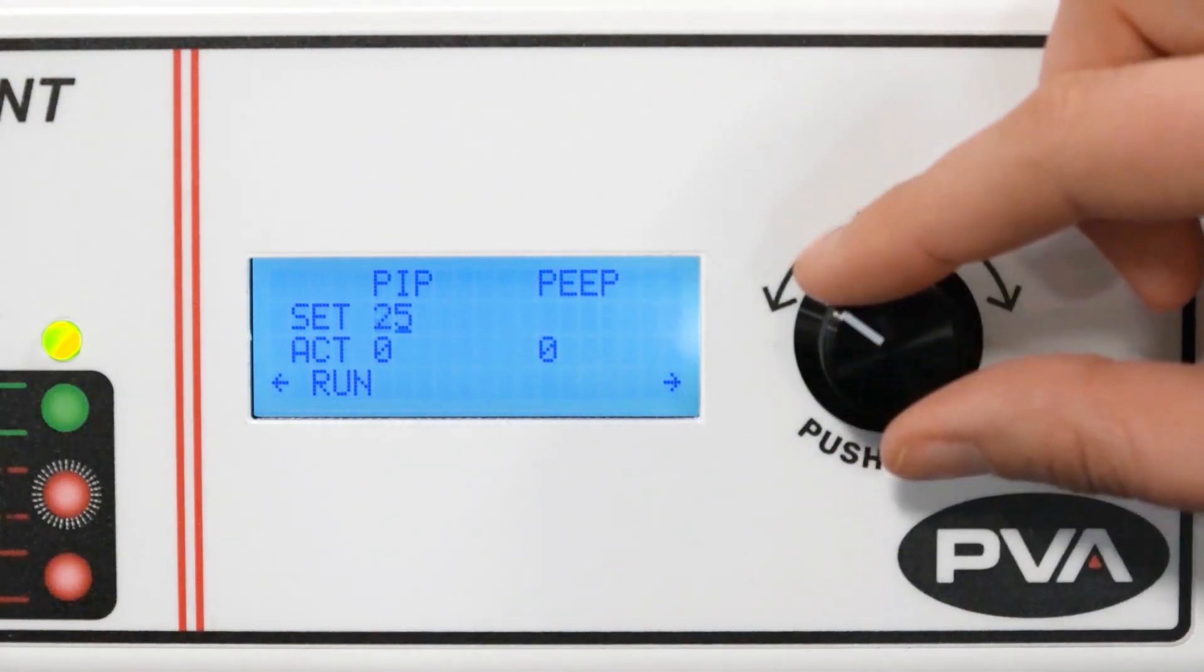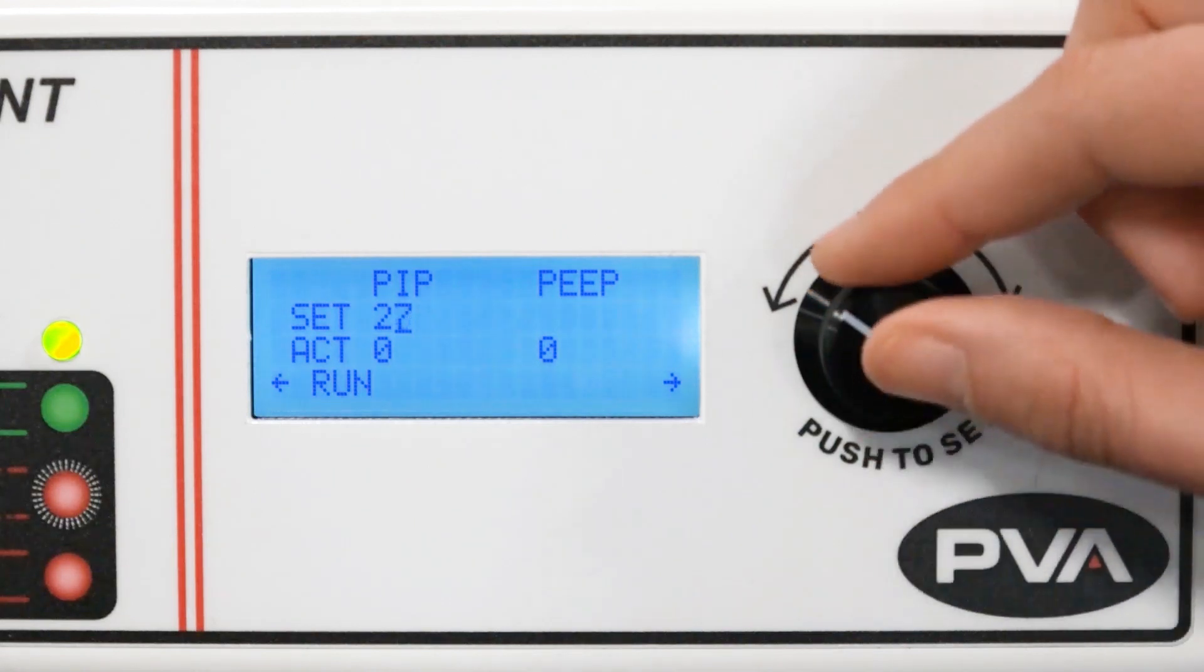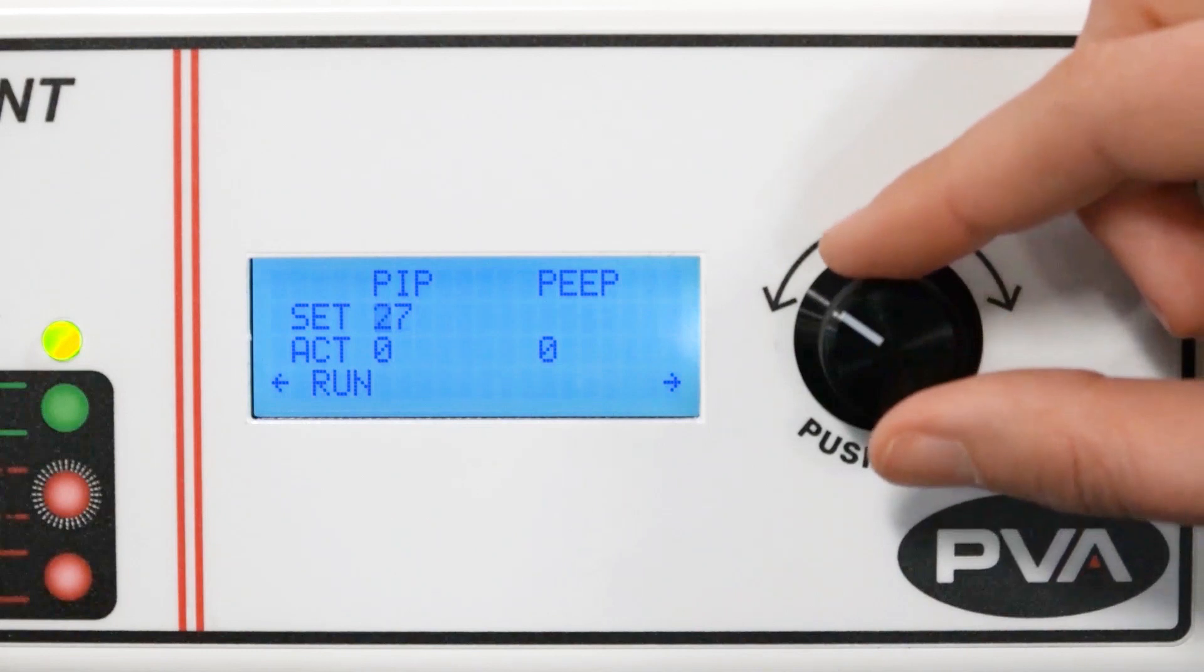On this screen, you will set your peak inspiratory pressure, also called PIP. The positive end expiratory pressure will be set manually on the peep valve.